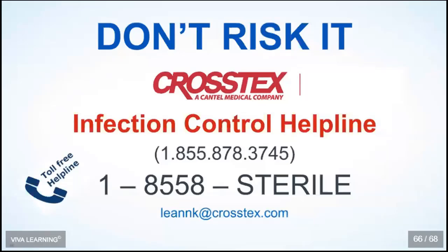Can you run instruments and handpieces on the handpiece cycle? That was a great question, Lisa. You need to follow the instrument manufacturer's reprocessing recommendations. You should have copies from each one of your instruments and equipment that you have in your practice, because you have to run that instrument based on the validation that's been provided by that instrument manufacturer. And remember, instruments and handpieces are two different types of things, because the handpieces are hollow, there are lumens, and so it's much more difficult to get the steam to penetrate all the way through the lumen in a handpiece as opposed to a solid instrument. So you need to follow both the instrument and the handpiece manufacturer's IFUs.